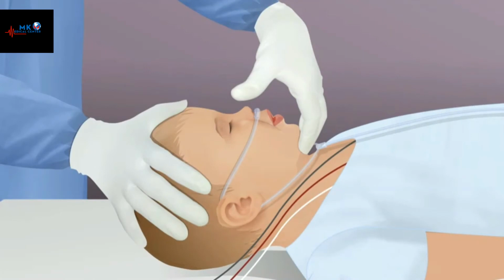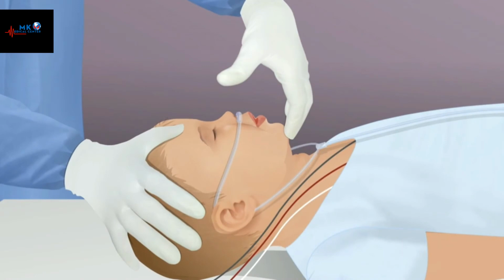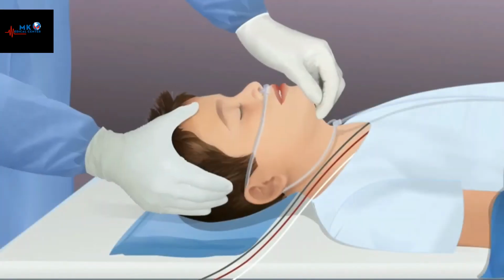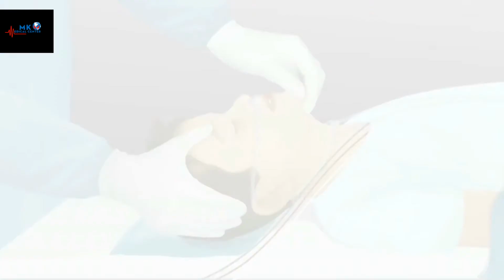Position the child supine so that the oropharyngolaryngeal axes are aligned. Position the child's head. Infant: place the head in neutral position on a flat surface with the chin in the sniffing position. Older child: elevate the occiput to the sniffing position and extend the head at the atlanto-occipital joint.